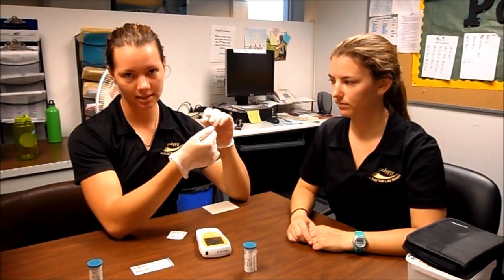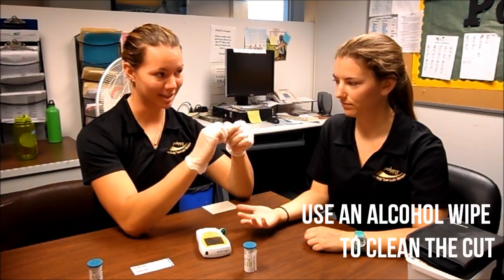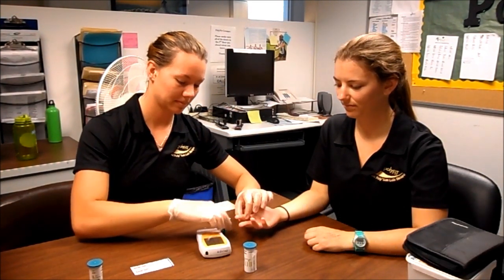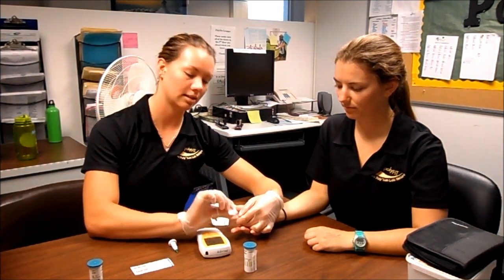Next, untwist the cap of the prick and ask for the client's finger. Take an alcohol wipe and clean it, then prick their finger. Squeeze some blood out, then clean it again so you have clean blood.